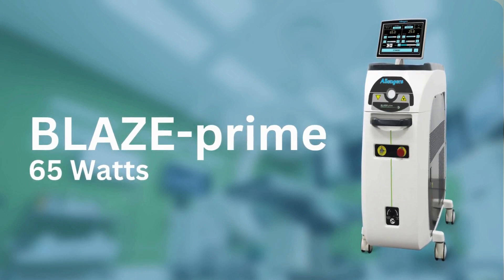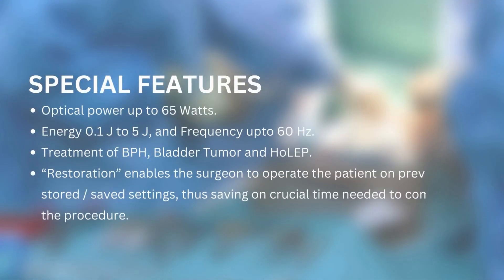Presenting the Blaze Prime 65 watts. Special features: optical power up to 65 watts, energy 0.1 joules to 5 joules, frequency up to 60 hertz. Treatment of BPH, bladder tumor, and HoLEP. Restoration enables the surgeon to operate the patient.